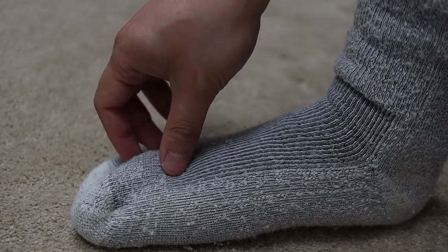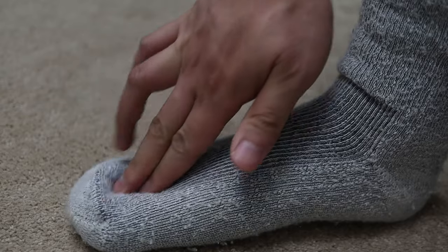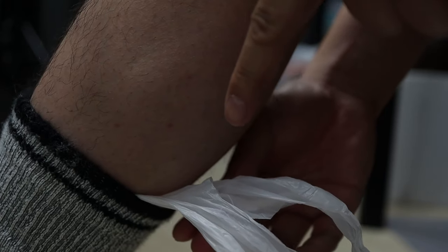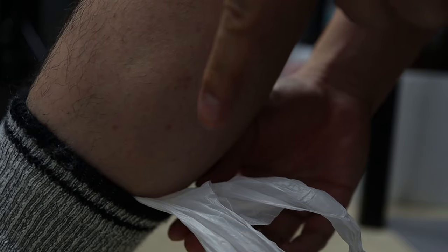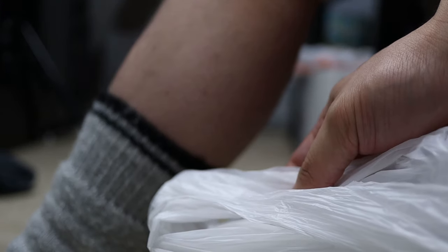Push the plastic out from between the toes towards the bottom of the ground. This makes it easier to remove the plastic later and reduces discomfort. Remove the plastic bag from behind the calf. Save your plastic bag to reuse the next time you use this trick.